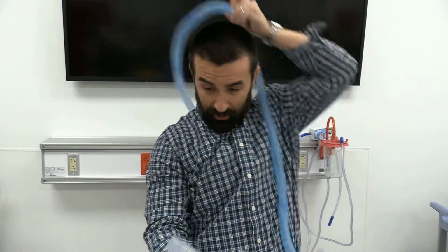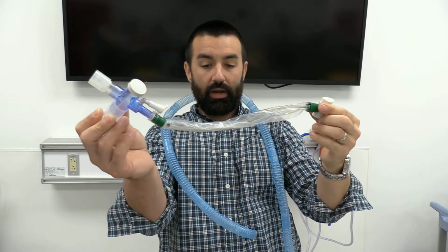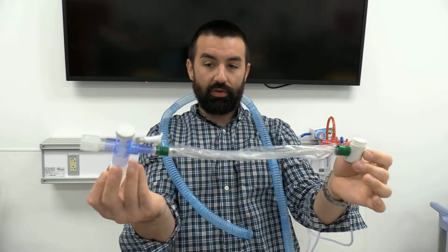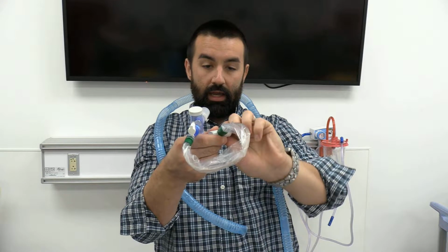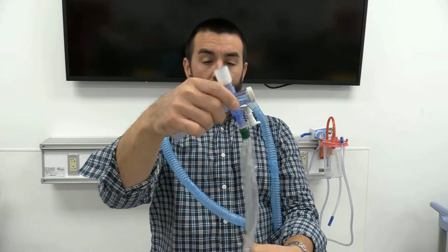An inline suction catheter, I'm going to wear this around my neck here for a second, gives us a reusable sterile suction catheter that we can advance down a patient's airway and clear them out. This is a shorter one. It's for use with a tracheostomy tube. We can hook suction up to this end, and we have a little button, and we can direct vacuum pressure to the tip of this. And we can pull a bunch of goobers out of there.